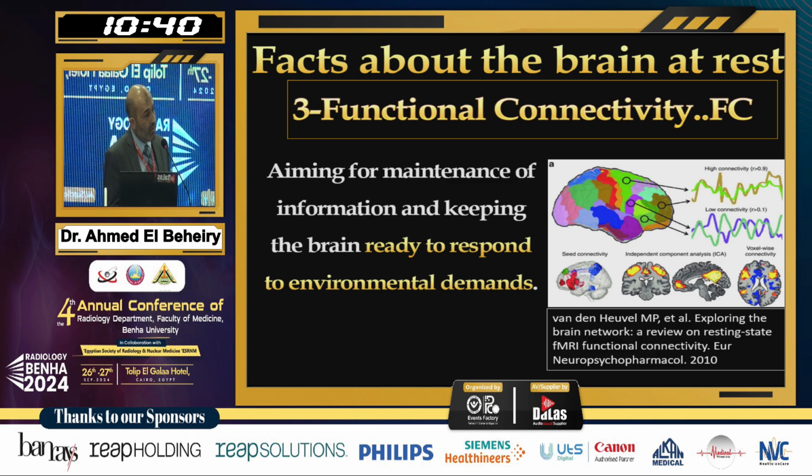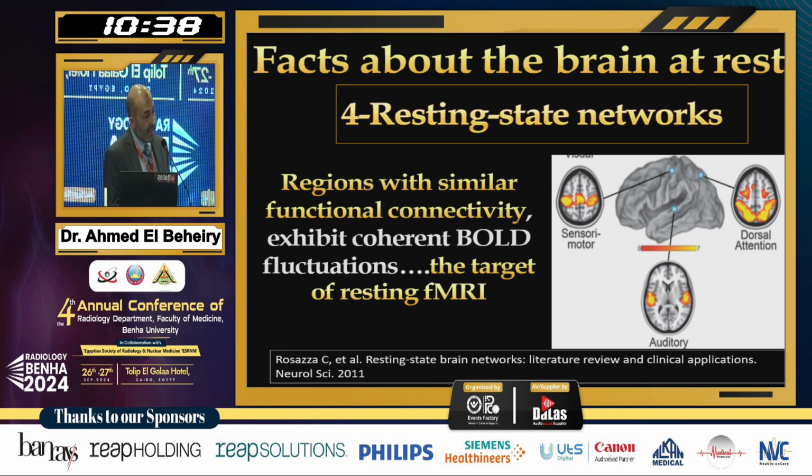for any environmental demands. And here comes the last terminology in this part, which is known as resting state networks. These networks are anatomically away from each other, but they are connected functionally, and this is the main target of resting state fMRI.